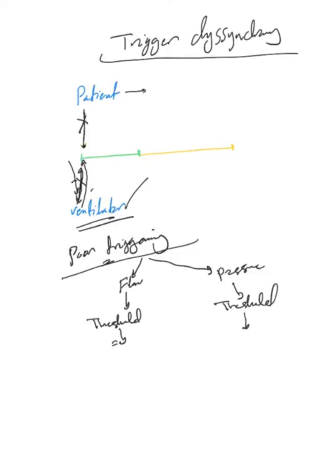The same thing here, the patient has to drop the pressure by a certain amount. And please refer to my videos on flow trigger and pressure trigger, but quickly refresh your memory.